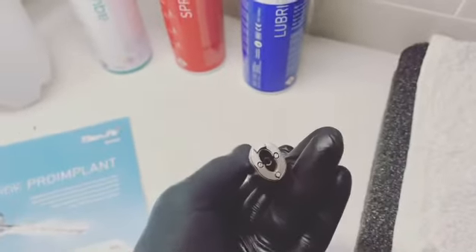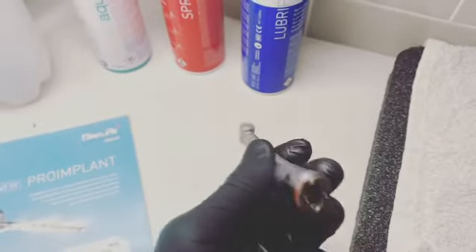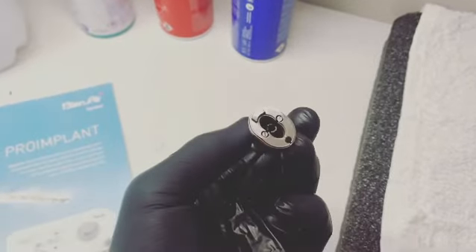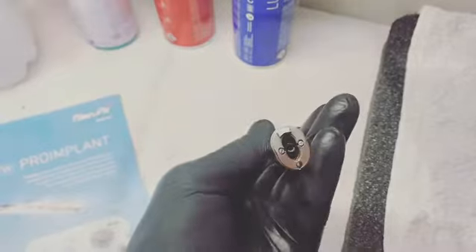Wow, look at this hand piece — looks like it was severely damaged. Maybe placed on a hard surface or thrown across the room. It's hard to say, who knows.